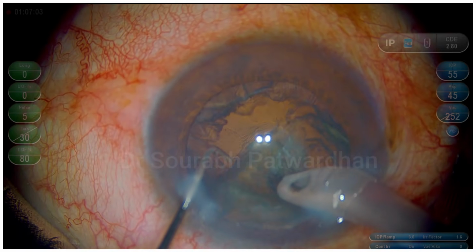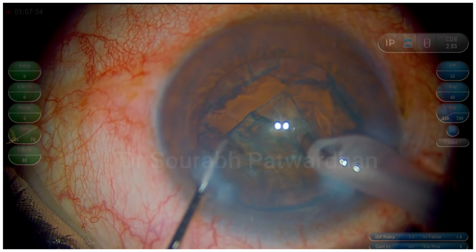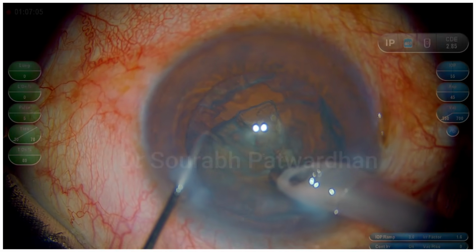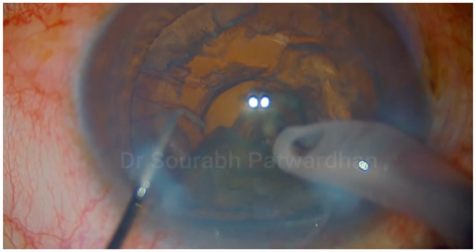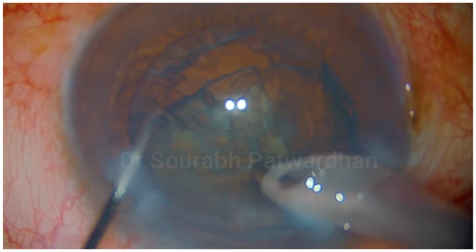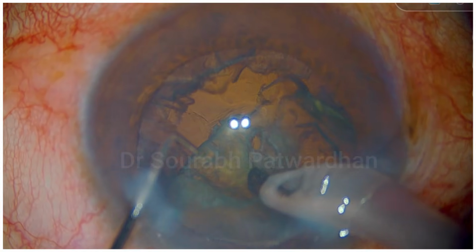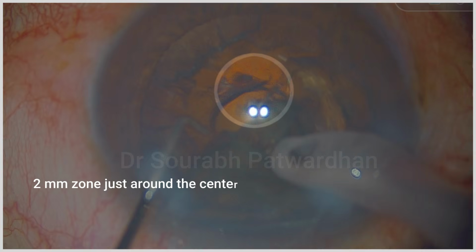So this was the moment where you can see that I was trying to take out the subincisional quadrant, and I was trying to emulsify it then and there itself, and that's why it just punched through the soft quadrant there and punched the posterior capsule.